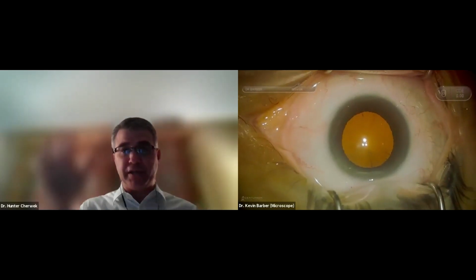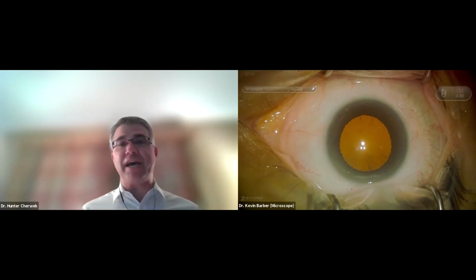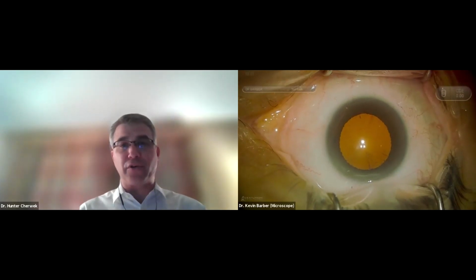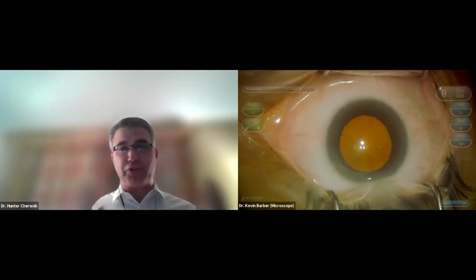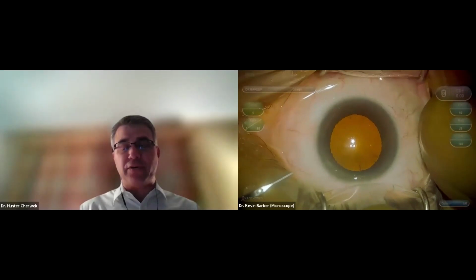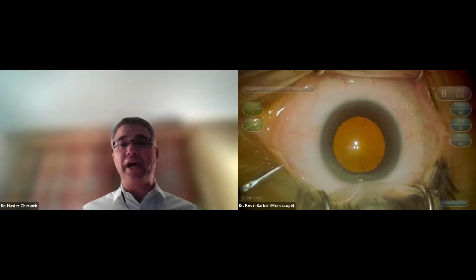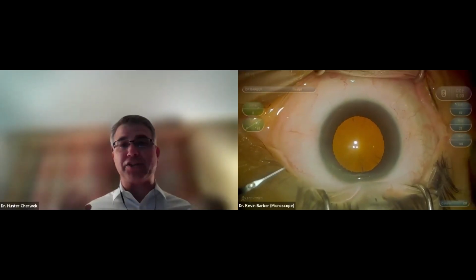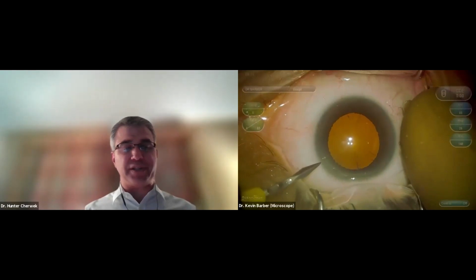It's positioning the patient, looking at the gonio lens, and you can practice a lot of that before you ever begin your first MIGS case. I'm sure Kevin will talk about how positioning and using the visualization prism and the look at the angle are very important steps that you can practice on any cataract case before you go to your first real live patient.